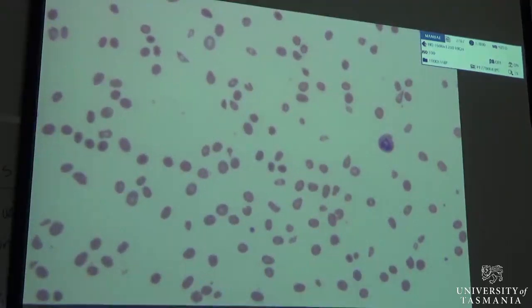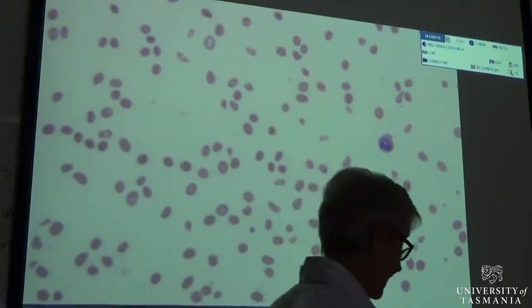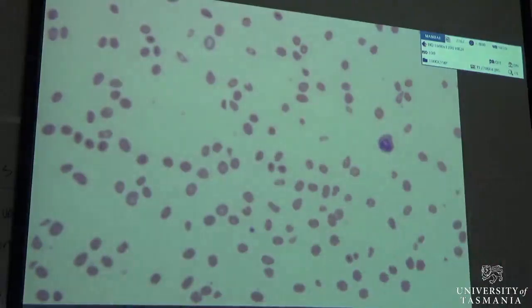The thing to remember with megaloblastic anemia is that all three lines of cells are being affected, and so we end up with a what, when all three cell lines are affected? A pancytopenia, yes, and we talked about that earlier, didn't we? Okay, so macrocytic normochromic anemia with pancytopenia and hypersegmented neutrophils. So they are the significant features of this film. So you could put something like query-megaloblastic anemia consistent with history, or just query-megaloblastic anemia would be fine.